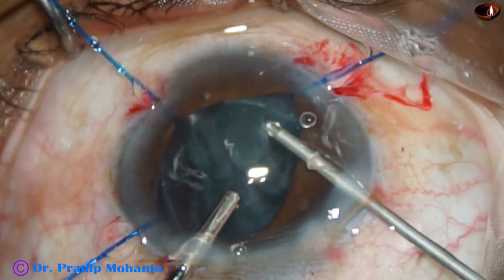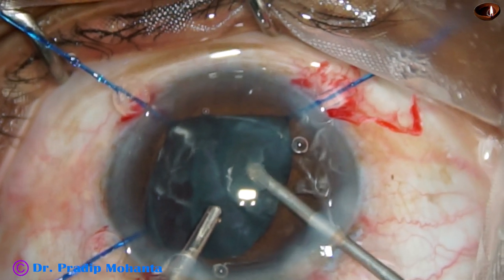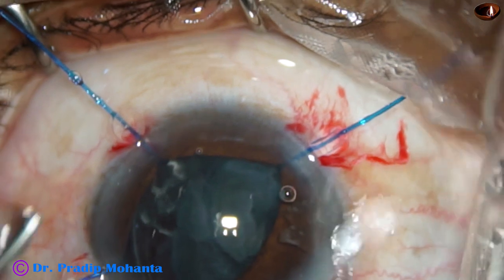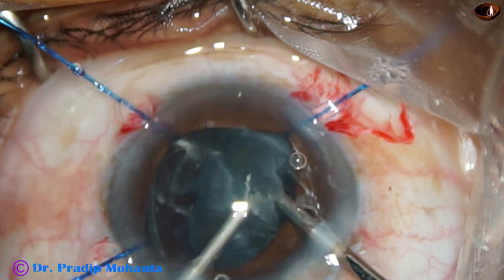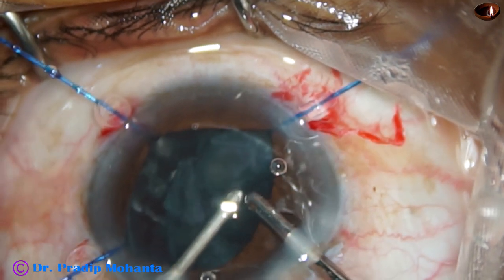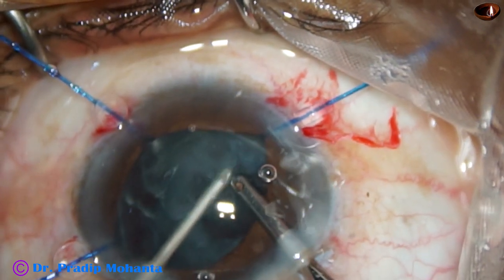Cooperation of the patient, cooperation of assistants, cooperation of all — the atmosphere in the OT should be like a temple, or a church, or a mosque — that kind of environment. Now I am using the cutter to remove some cortex also.